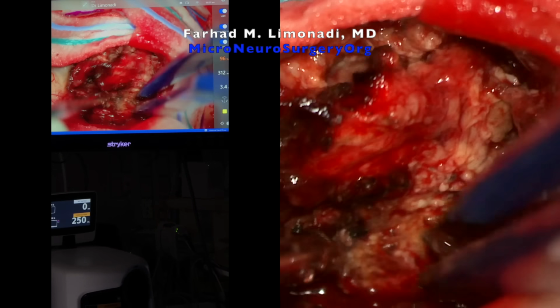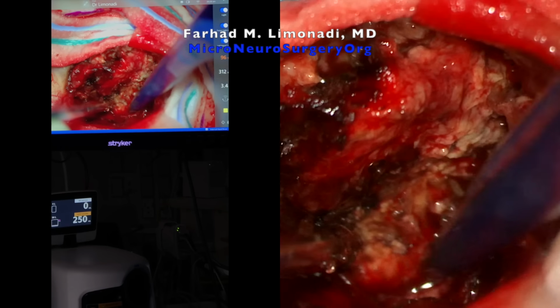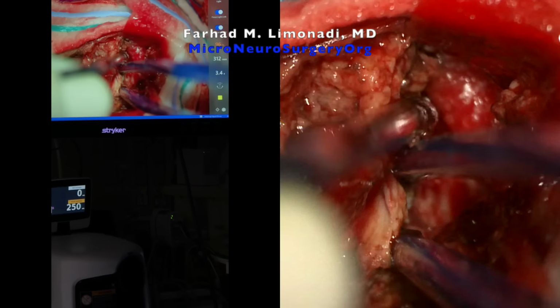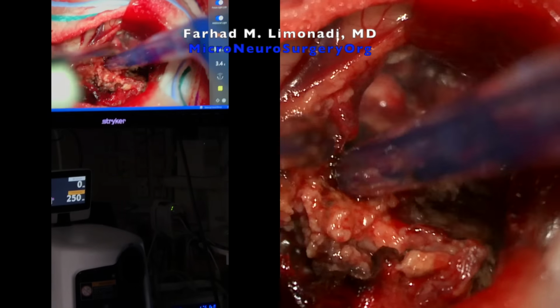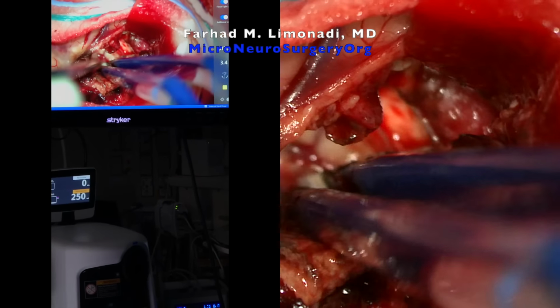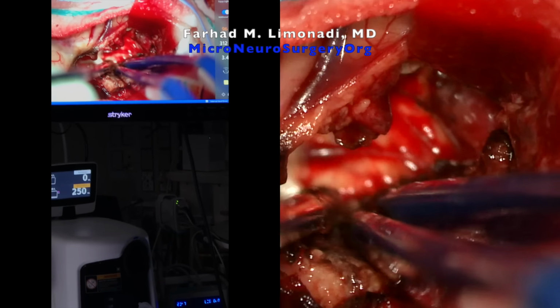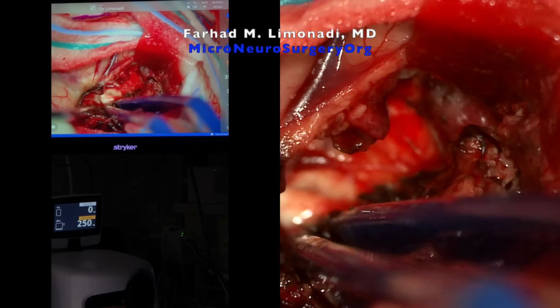And here's the capsule again, only by bipolarizing the tumor and the capsule of the tumor, making it somewhat harder and more distinct, without any damage to the frontal lobe, very carefully, and making sure we follow it through all its borders.